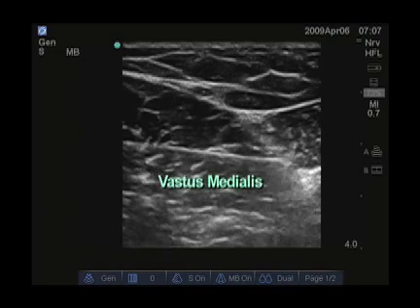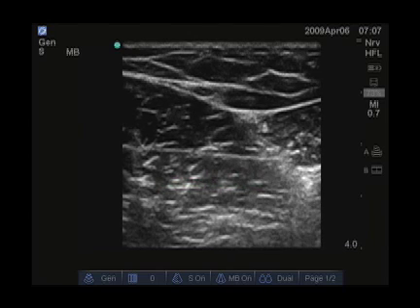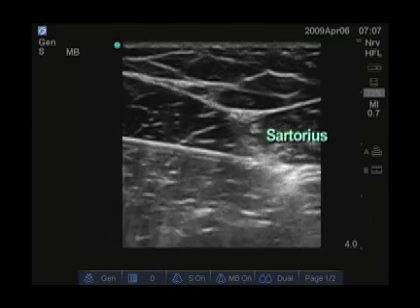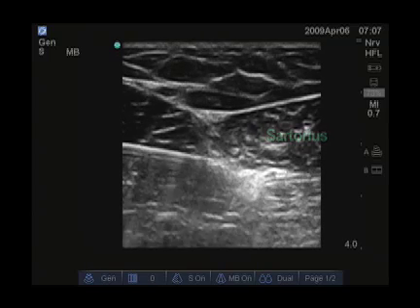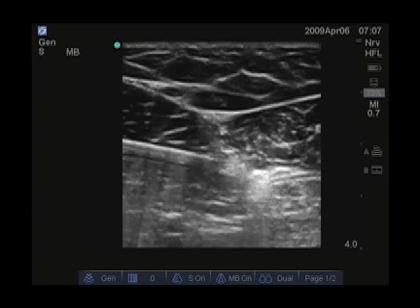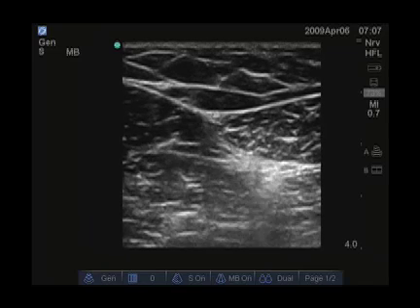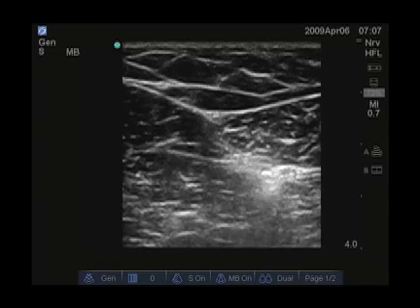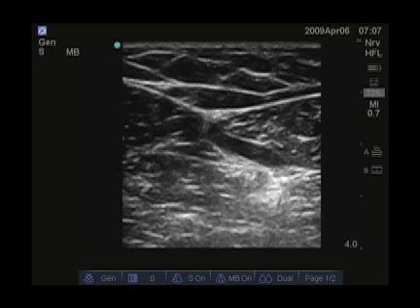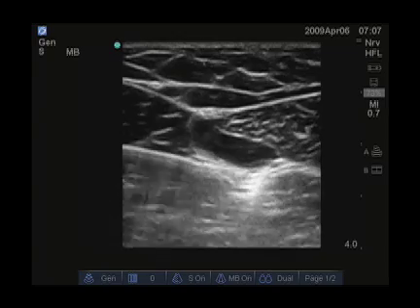Here our needle is advancing through the vastus medialis. We try to position the tip of the needle underneath the sartorius muscle, which is located to the right of the screen. You can see the hyperechoic areas, some of which may represent the nerve. Our needle is now directly below the sartorius muscle and you can see the local anesthetic spreading below the sartorius muscle to track to the saphenous nerve.